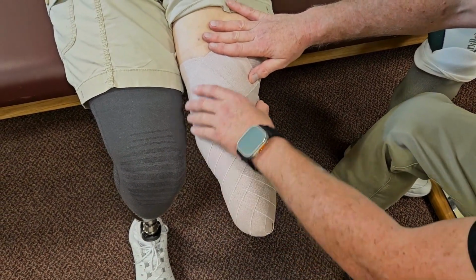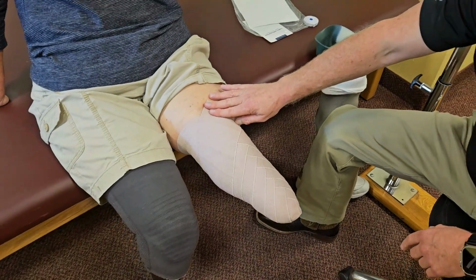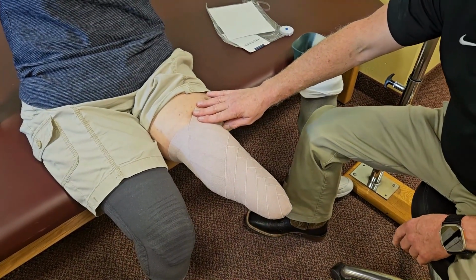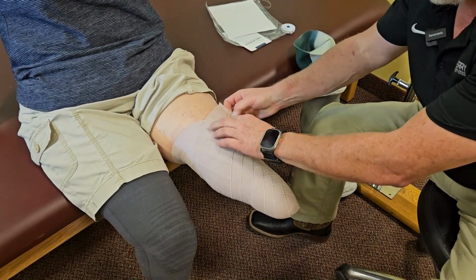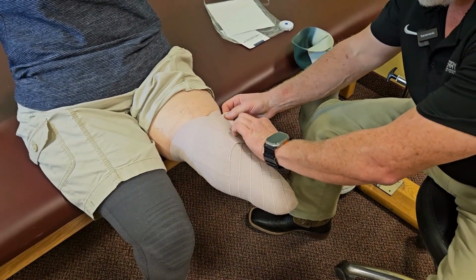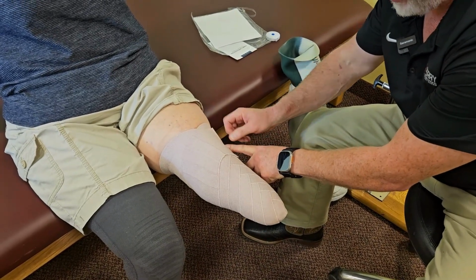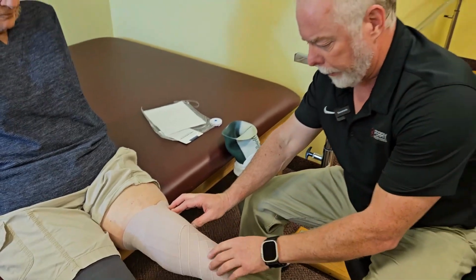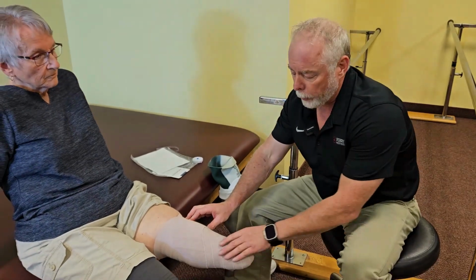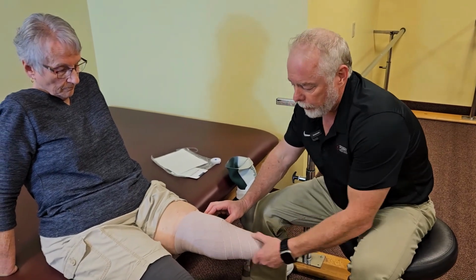If they're not quite ready for a shrinker sock or an increased size shrinker sock, then we wait and give it the couple of days or a week that it needs, then get them into a shrinker sock. Better that than to have an elastic wrap around them improperly, not because it was put on that way, but because they moved and it slid down and created some issues. So Theron, we can move on to the next slide.